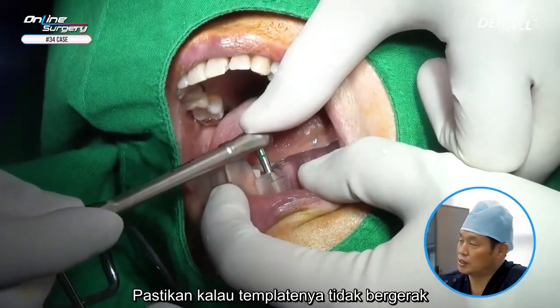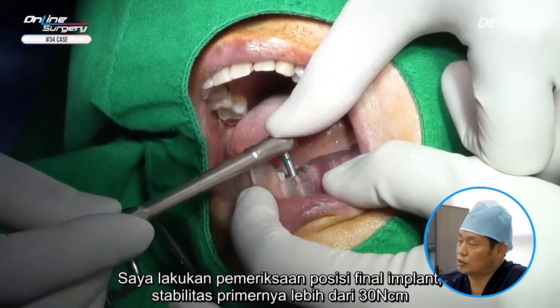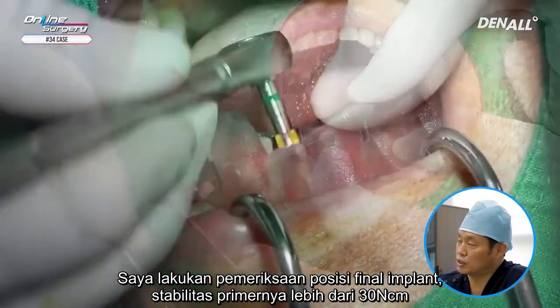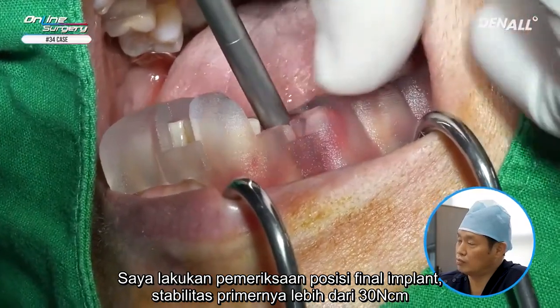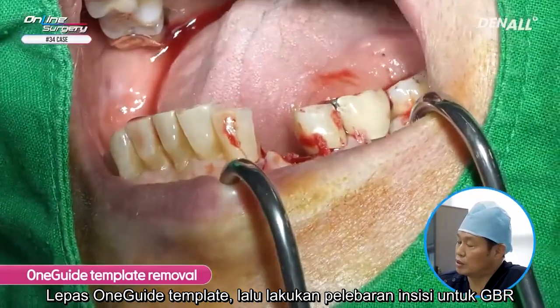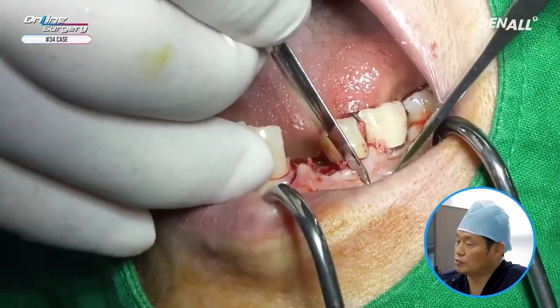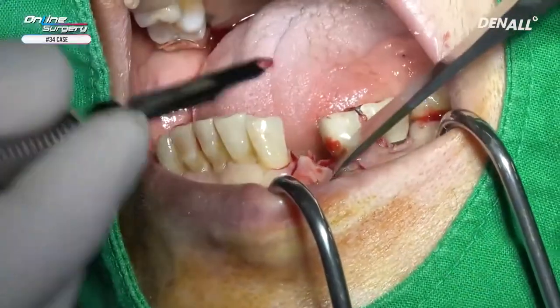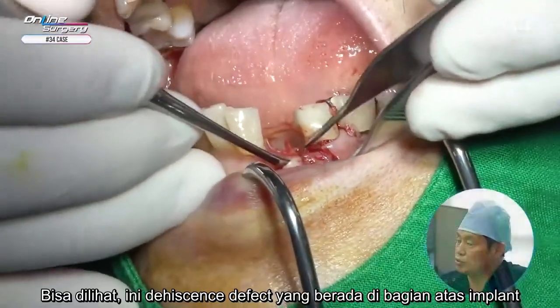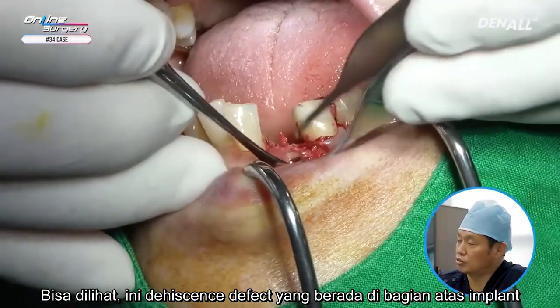Make sure that the template does not move. And I'm checking the final position of the implant. Primary stability is over 30 Newton centimeter. One guided template is removed. For GBR, the incision is going to be extended. As shown, there is a dehiscence defect superior to the implant.